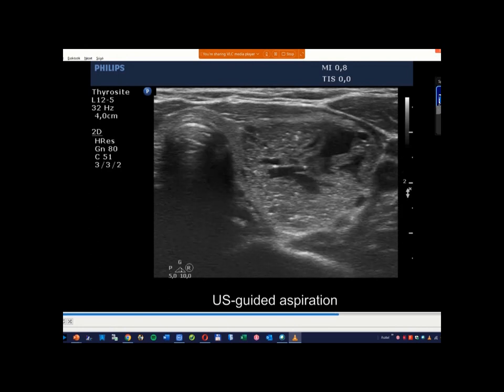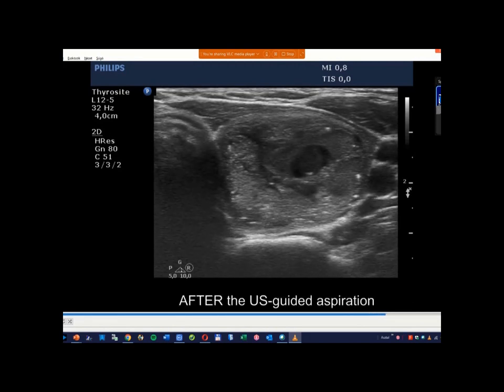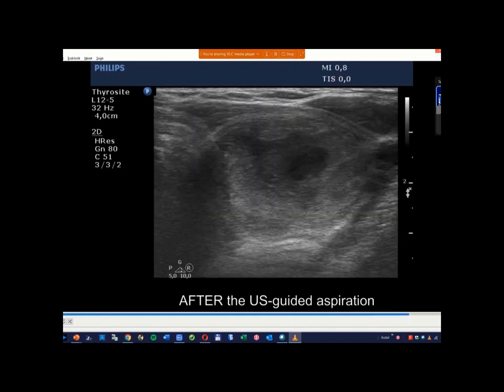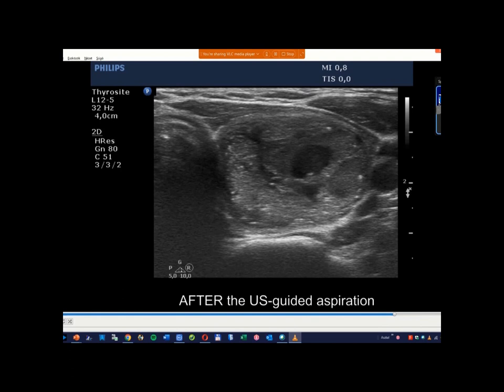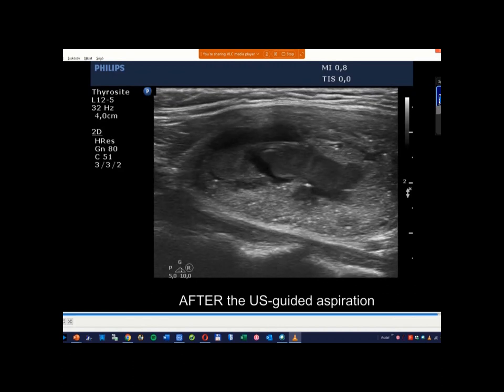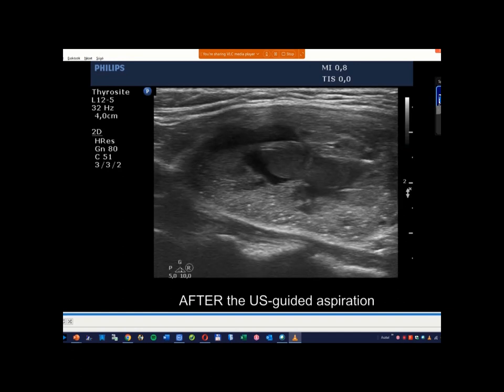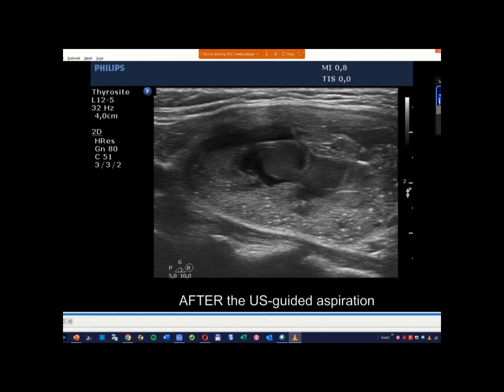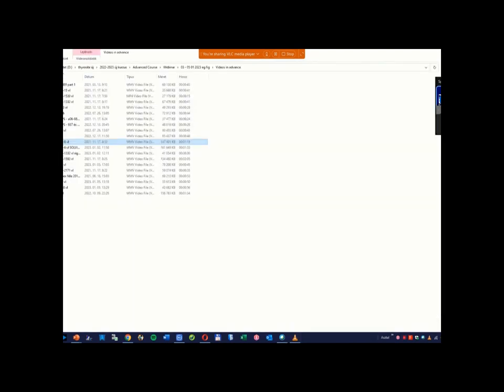And as I mentioned, I had serious doubt regarding this consideration, but I analyzed videos of almost 500 malignant cases, and I could not find even a single typical comet tail artifact. Here, I guess, is another one. Okay, it is very difficult. I'm convinced because I analyzed hundreds of malignant cases, and you have to trust me, and trust another man, even an expert, if we have no personal experience. But I guess that the presence of a single comet tail artifact should calm us down. The real importance will be emphasized in the last part of the webinar.